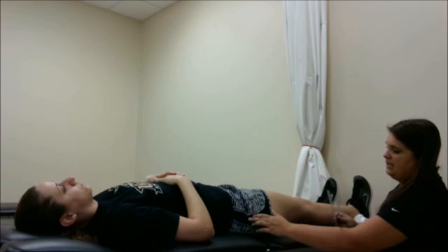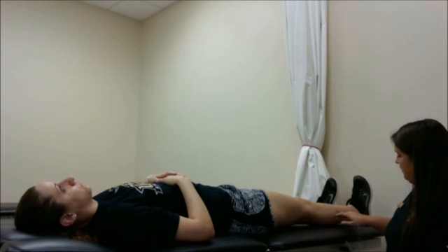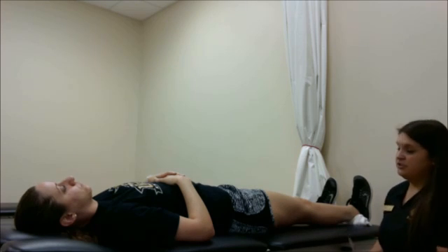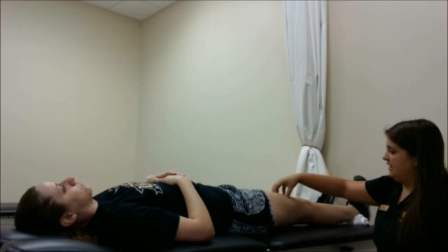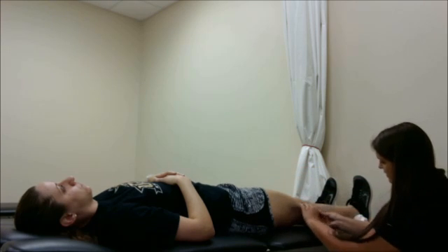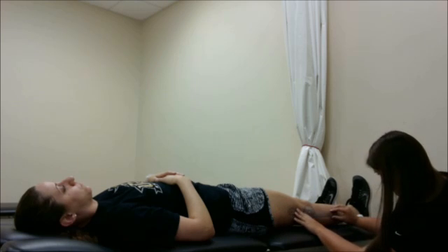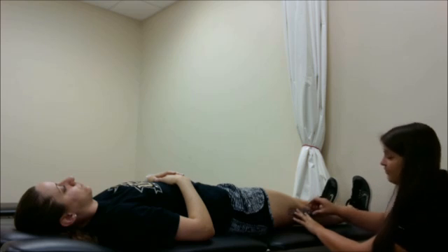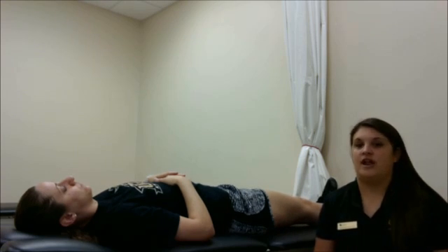The stationary arm is going to head up to the trochanter following the midline of the thigh, and the movable arm is going to follow the midline of her shin. To make sure we max out full range extension, I'm going to have my patient do a quad set — go ahead and flex your quad. We're fully extended now. I'm actually getting one degree of hyperextension here. Zero degrees would be the normal range for knee extension.